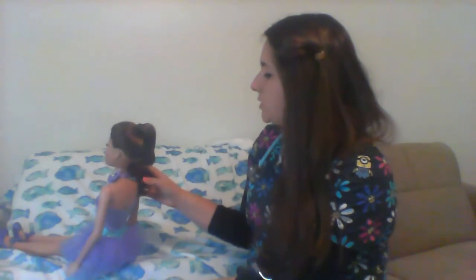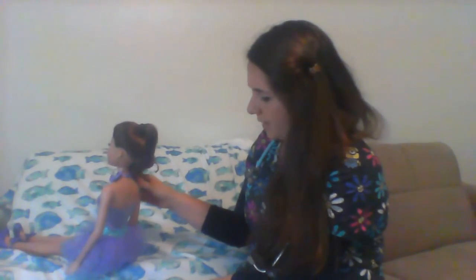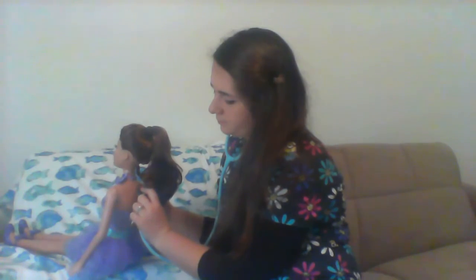While we're here, we're going to have Barbie do range of motion with her neck. Make sure that she can, again, rotate it, put it side to side, make sure she has good range of motion. And then we're going to listen to her lung sounds. Same kind of way as we did before. You want to go side to side from top to bottom. And you want to make sure that they're clear, like they were in the anterior thorax. Again, you want to make sure that you hear lung sounds, and no absent or bad lung sounds.